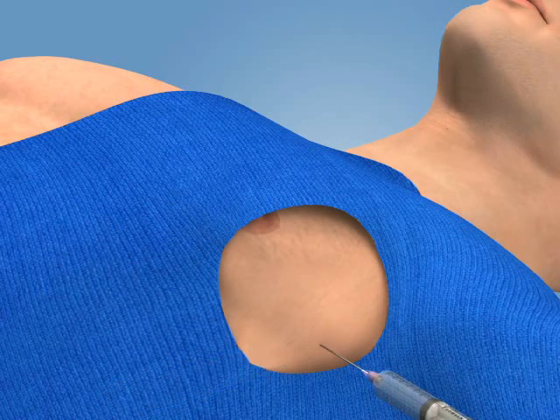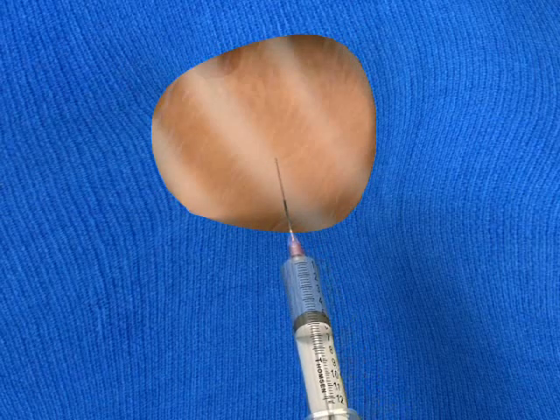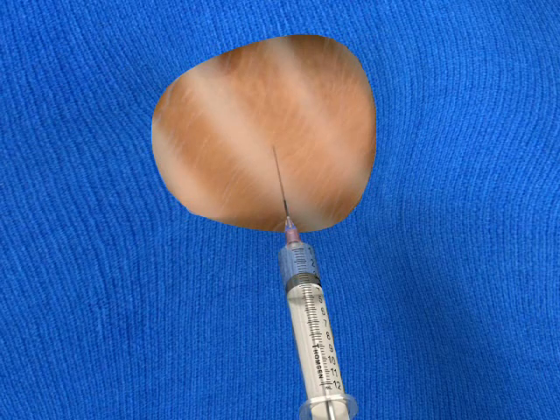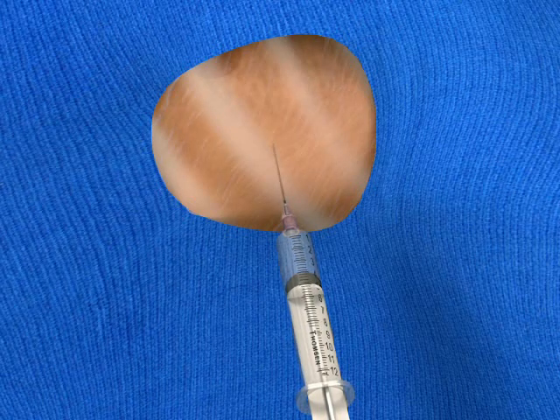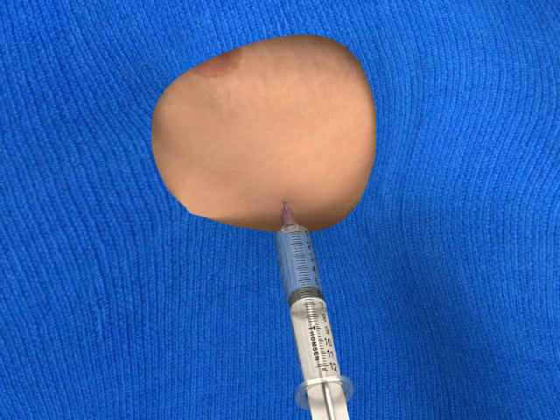Switch to a longer 22-gauge needle and advance it through the wheal and anesthetize the deeper tissues. Direct the needle over the superior aspect of the rib, alternately injecting anesthesia and aspirating back on the plunger. Fluid or air will fill the syringe when the pleural cavity has been entered. Inject additional anesthesia at this point to anesthetize the highly sensitive parietal pleura.